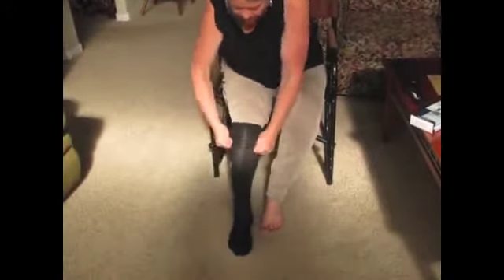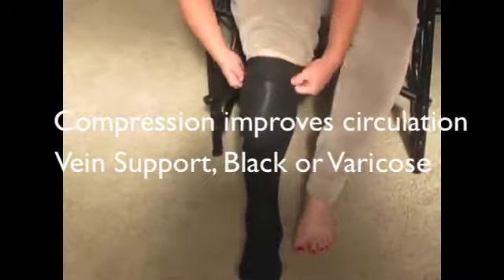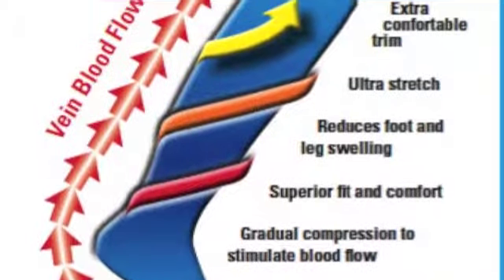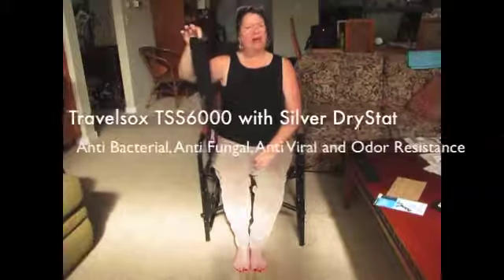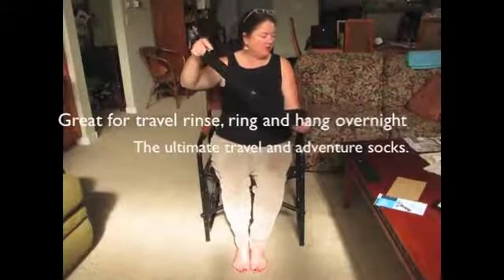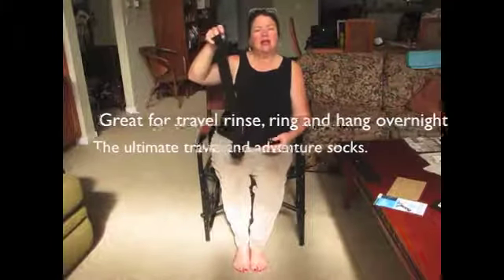They're comfortable, easy to use, and you can see it goes all the way up my calf. You don't need to dry these in the dryer. To save energy, just hang dry them. They come out of the washing machine almost completely dry. They're made with a Silver DryStat material that's anti-bacterial as well as odor-free. You can walk away.